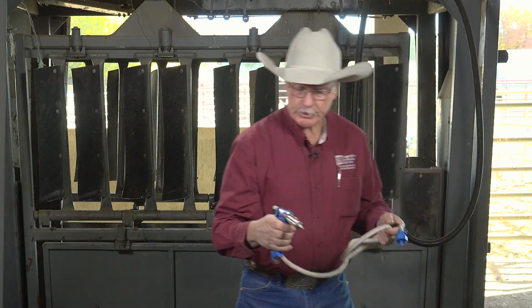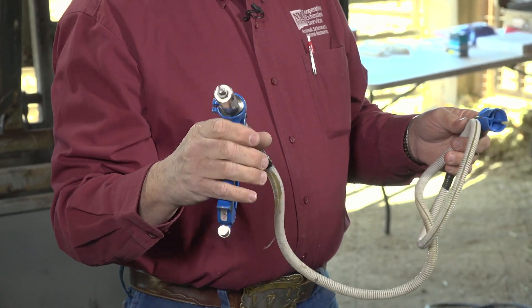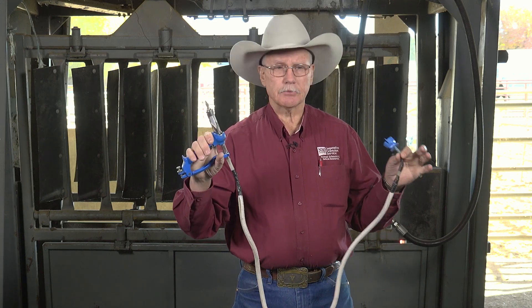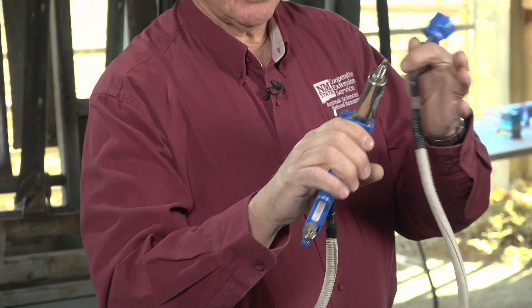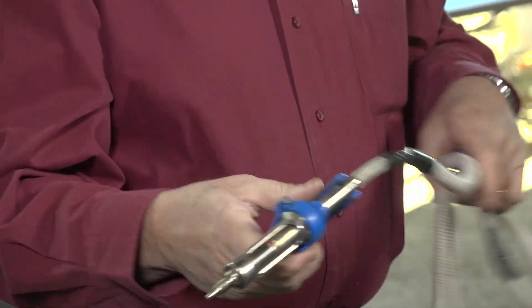This is a larger syringe — this is adjustable, a 10cc that can be adjusted down. They're not quite as accurate as some of the smaller ones, but if the dosage is larger, this is likely something that will be used. It's the same design. Once you fill the line and work the air out of it, it will stay and you can just vaccinate as you go along the line.